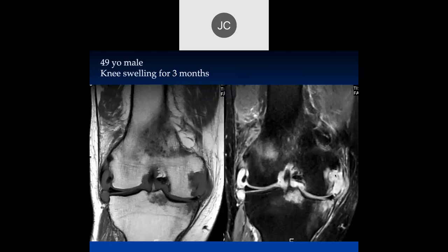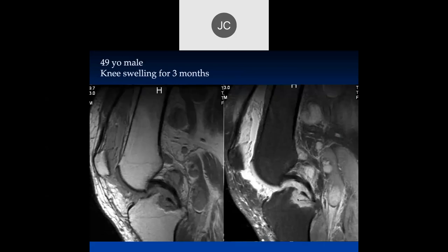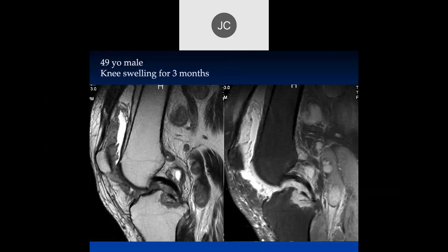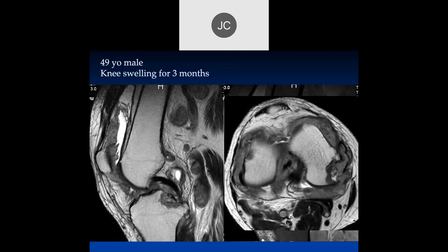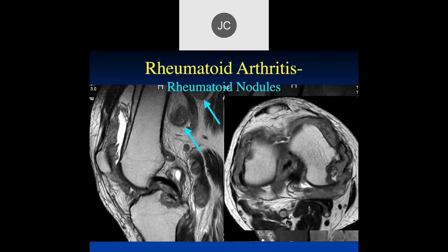In this 49-year-old male with three months of knee swelling, there are marginal erosions, diffuse edema within the intercondylar notch and tibial plateau, synovial thickening, and extensive pannus formation with large bone erosions. Rheumatoid nodules are also present more proximally. This is rheumatoid arthritis with extensive pannus.